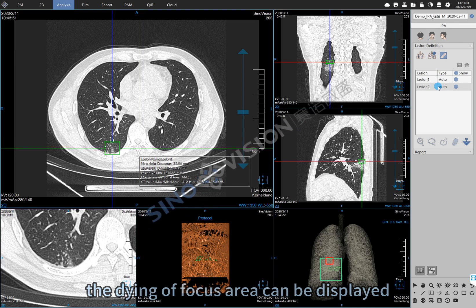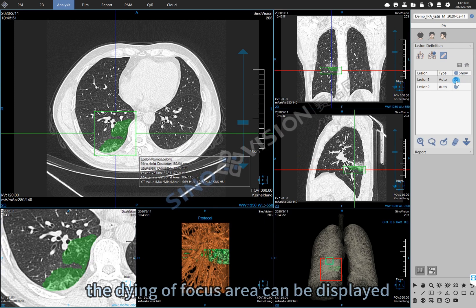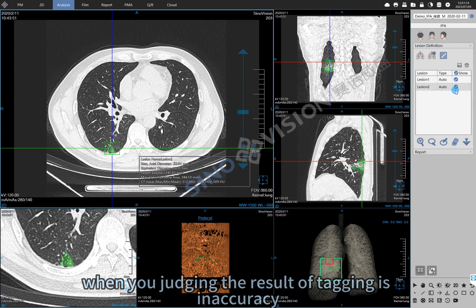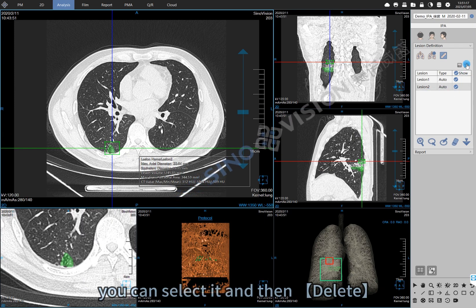Selecting a lesion, the highlighted focus area can be displayed. When you judge that the result of tagging is inaccurate, you can select it and then delete it.